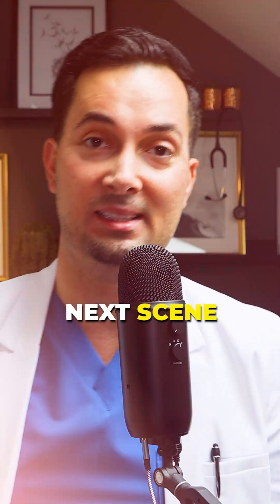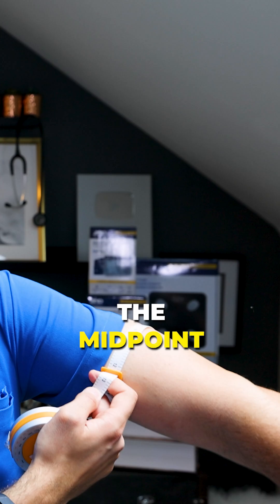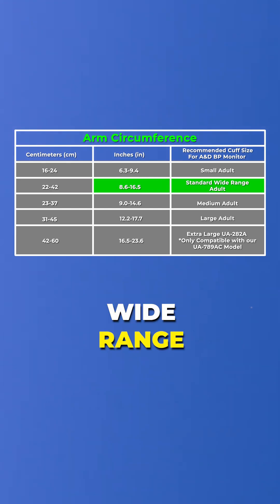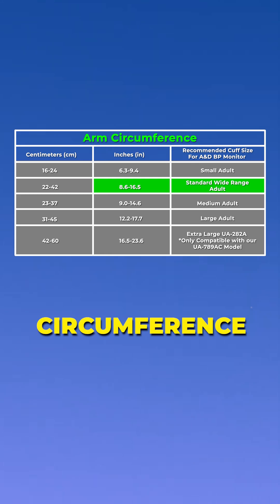I'm going to take my coat off for the next scene. Now that I've taken my white coat off, you can see I've wrapped my tape around the midpoint so I can calculate my arm circumference, which is about 12 and a half inches. So it fits within the standard wide range adult, which is 8.6 to 16.5 inch circumference.